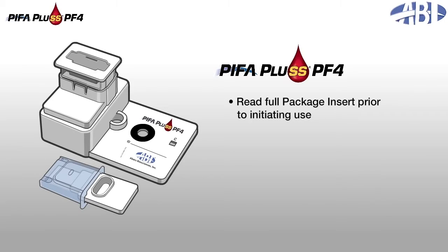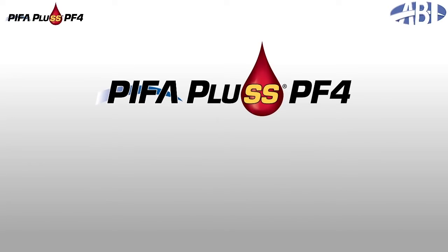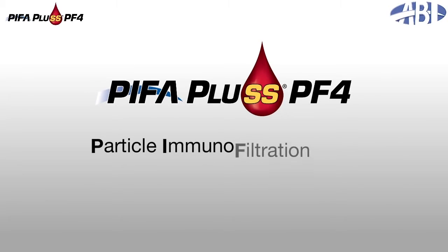Please review the package insert prior to initiating use to ensure that recommended testing and quality control procedures are followed and appropriate safety precautions are taken. PIFA Plus PF4 is based on principles of the Particle Immunofiltration Assay, PIFA.